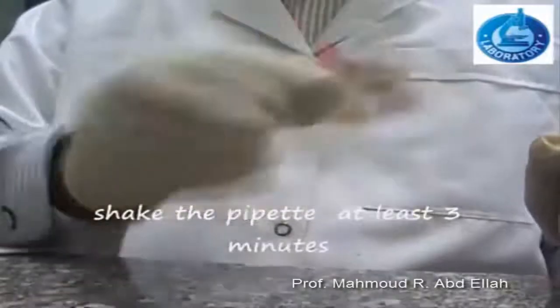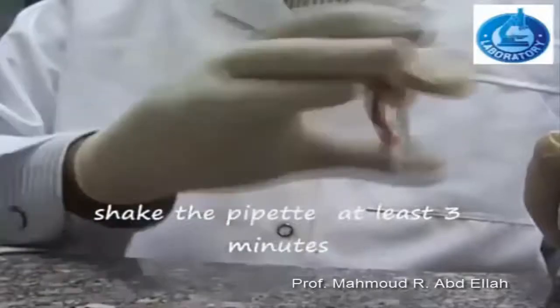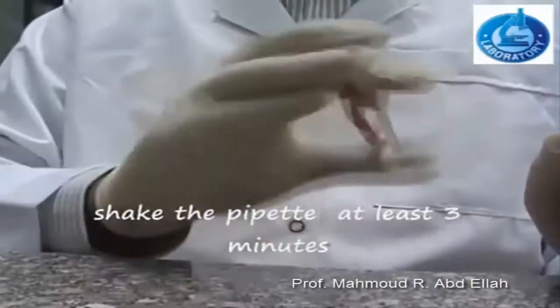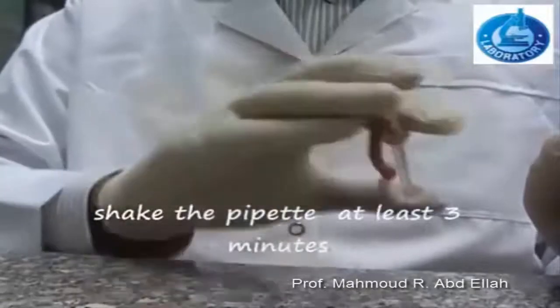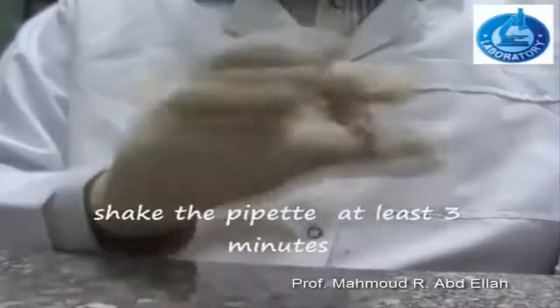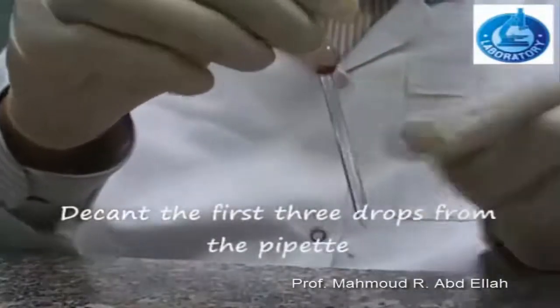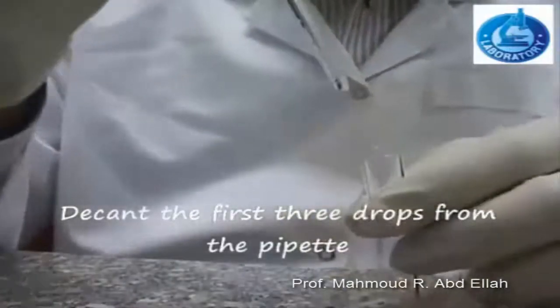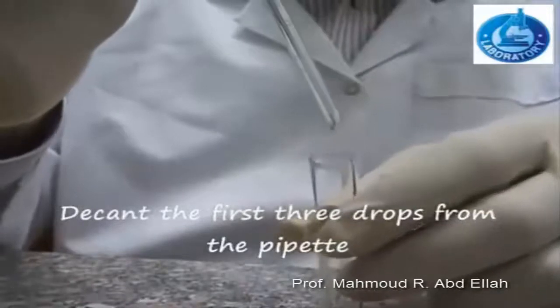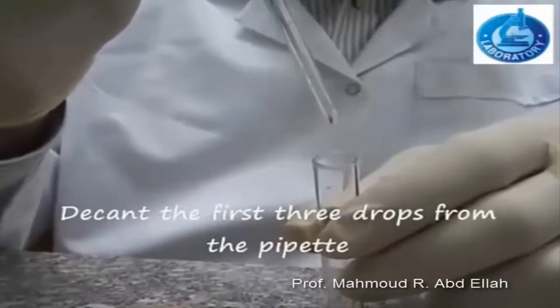Draw the diluting fluid, which is normal saline 0.9%, until mark 101 located above the bulb. Mix the pipette for at least 3 minutes. Mixing of the diluting fluid with the blood is done only in the bulb. Discard the first three drops from the pipette, which contain all the diluting fluid located in the stem of the pipette.